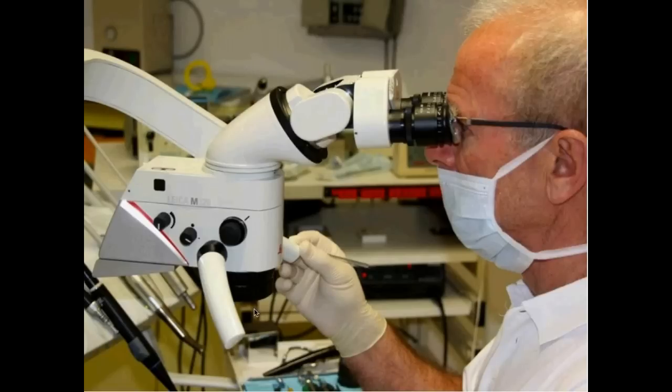So the assistant has to know that you're not looking from here to here, but from the lens downwards. But that takes just one session, and they learn. That's not difficult, and it's very easy to explain, because if the fingers or the instruments of the assistant are in the light of the microscope, they will be in your field of vision. So they will always know when they are disturbing you in your work.